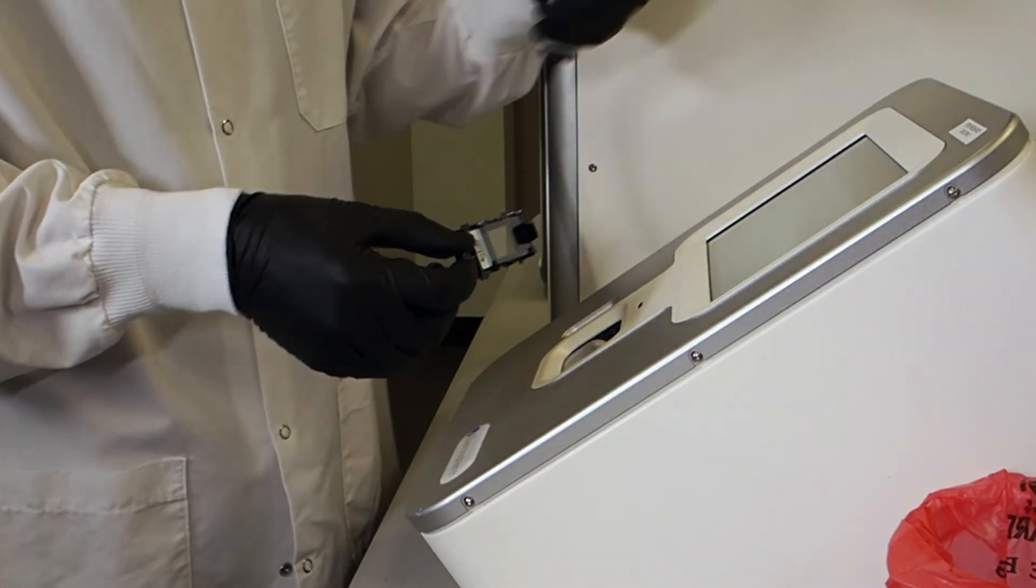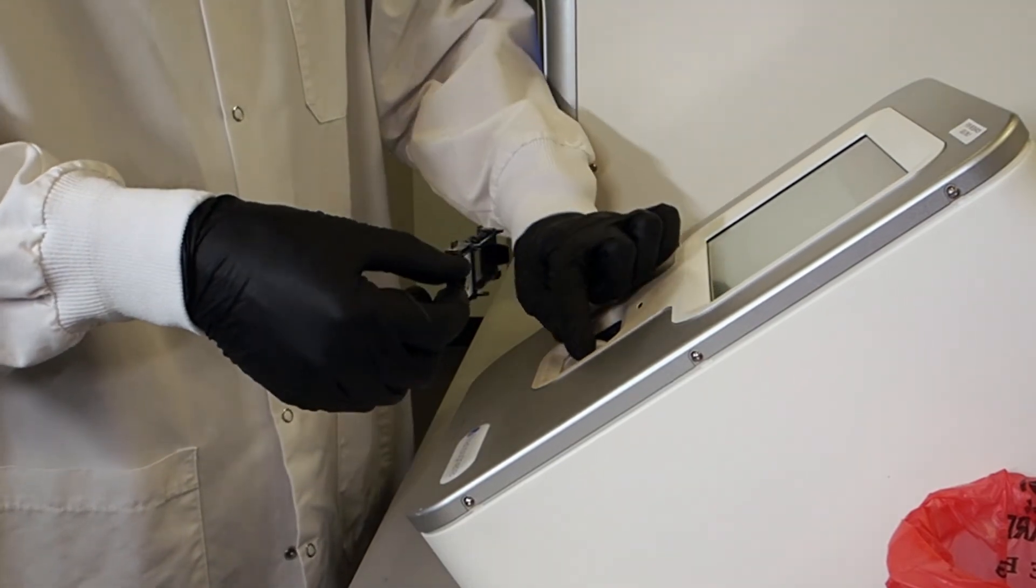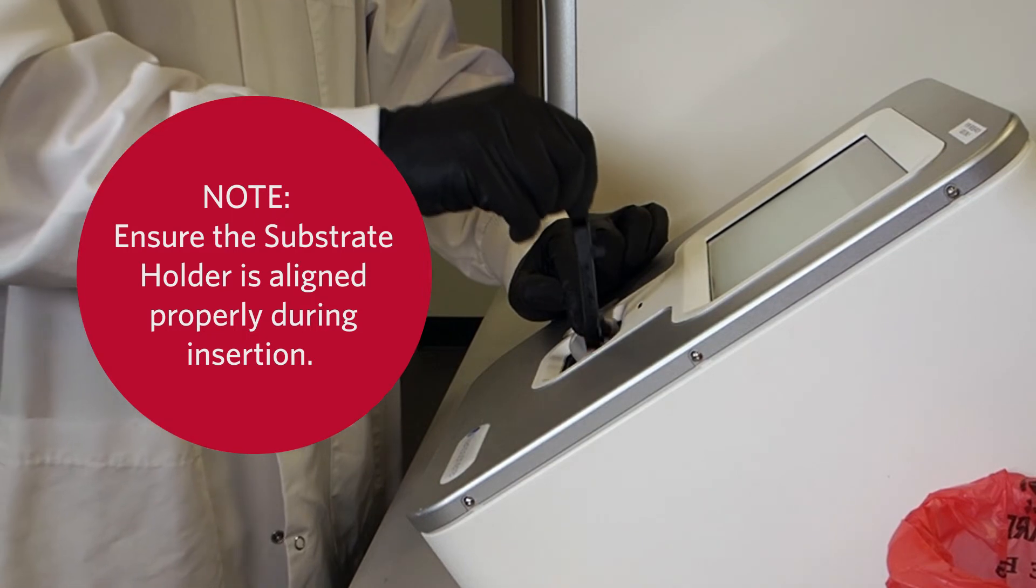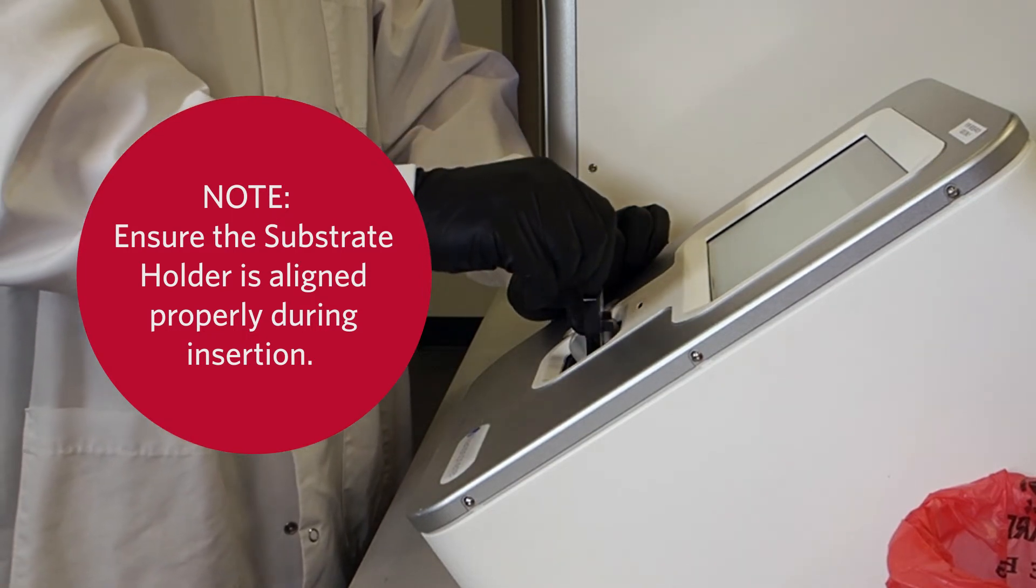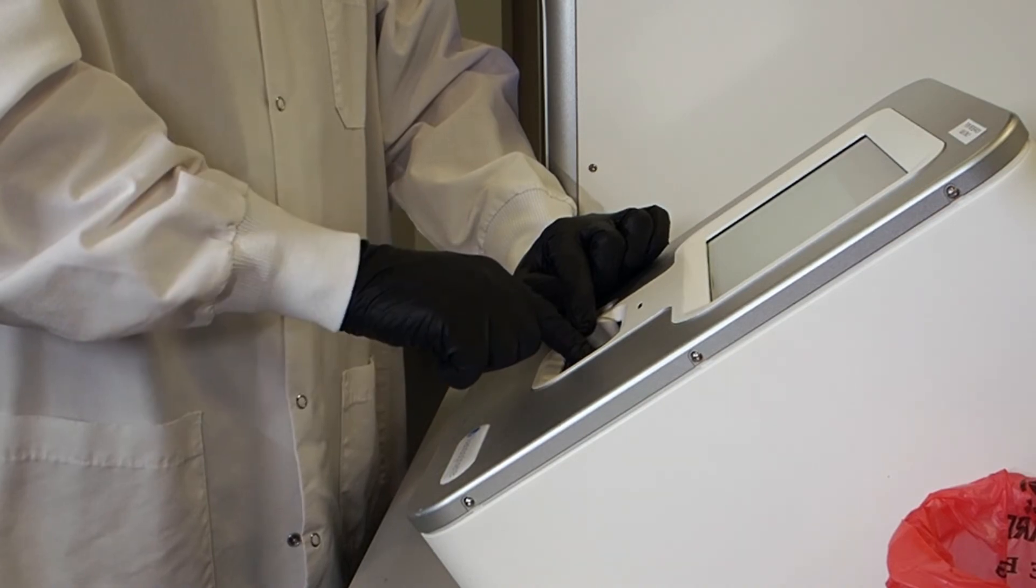Use the barcode scanner to scan the barcode, then insert the substrate into the reader. To ensure the substrate is aligned properly, let the substrate holder drop into the analysis compartment and then press all the way down.